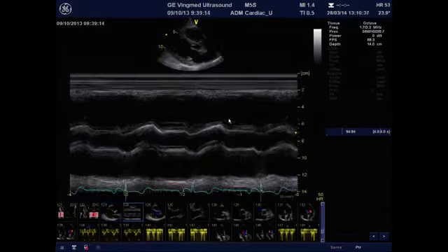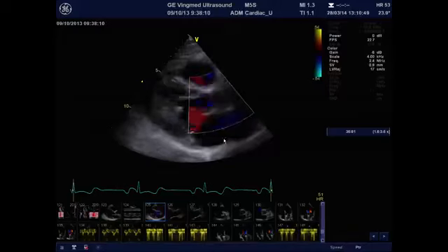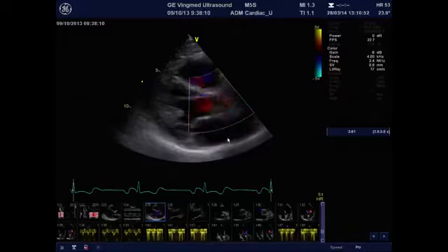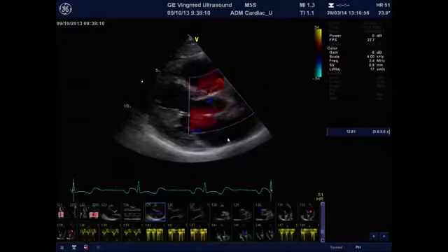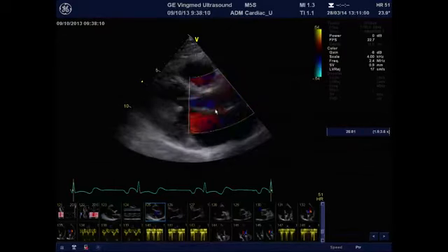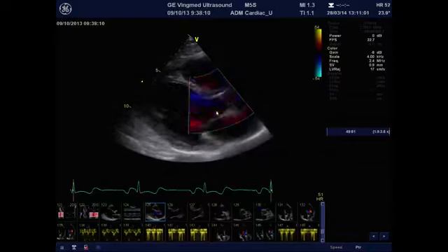You can also use the M-mode to assess the movement of the leaflet. Here you can see the opening of both leaflets during the systole. After, you can put the color Doppler, and with the color Doppler you can assess the presence of significant leakage. Here you can see that there's some small leakage that are strictly normal and refer to the normal backflow closure.